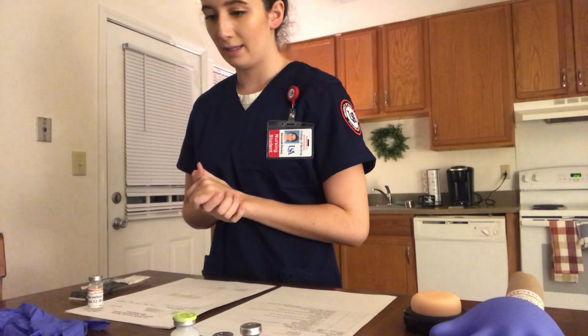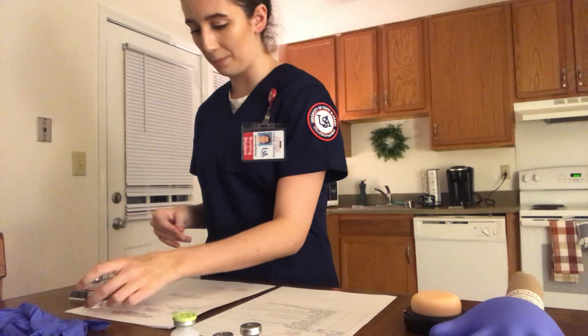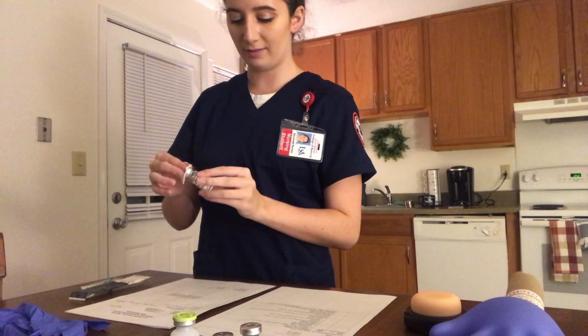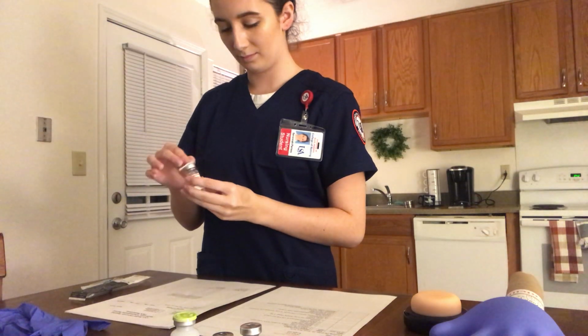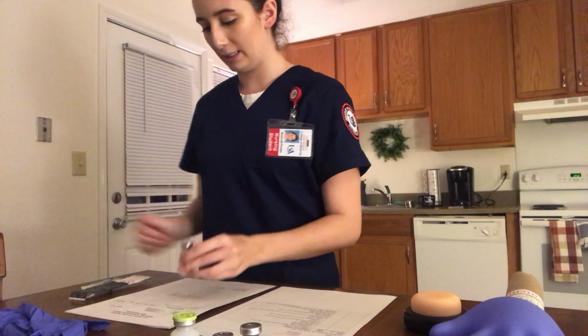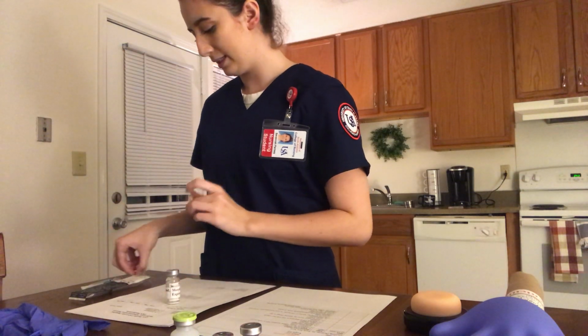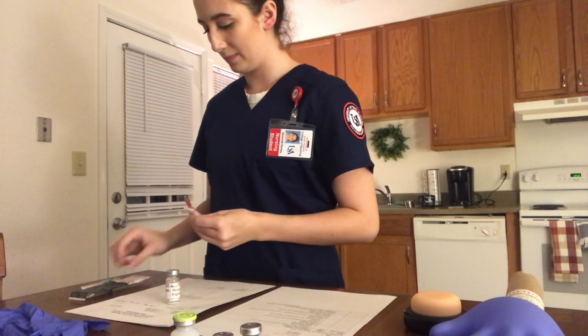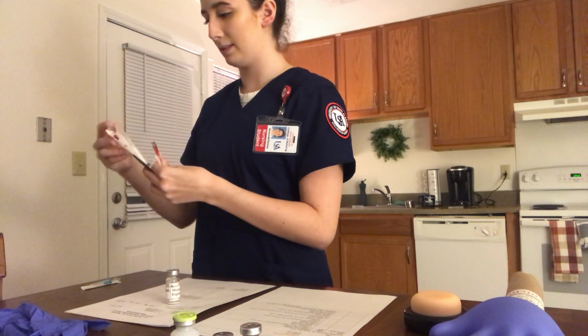The first thing I will do is take an alcohol swab and clean the top of the vial. After cleaning the top of the vial using sterile technique, I will grab the blunt fill needle.